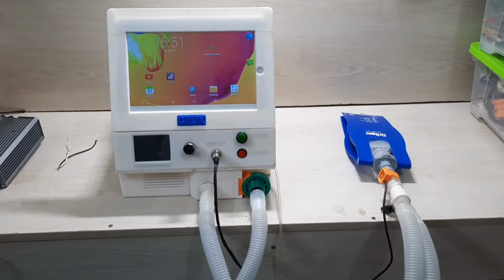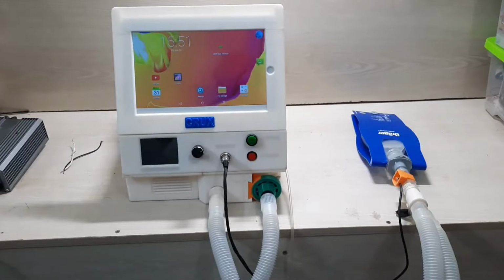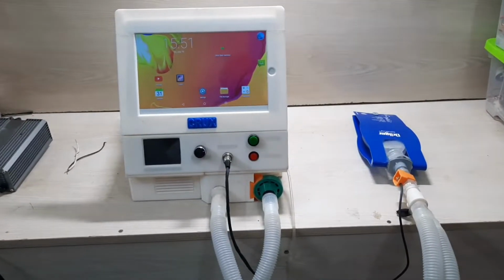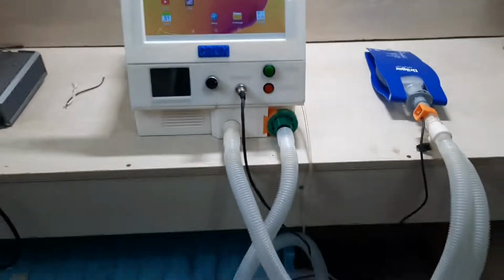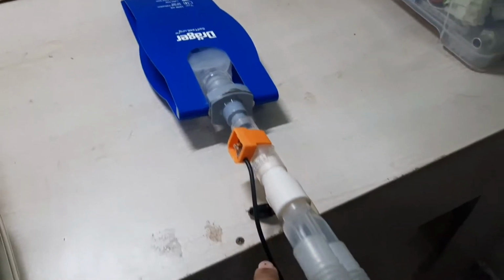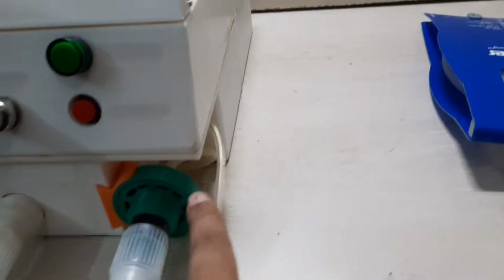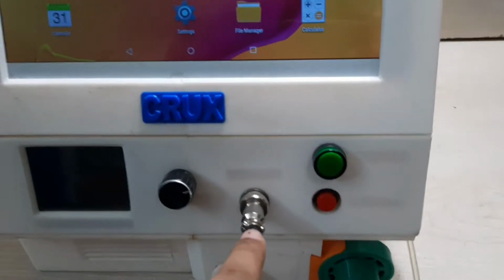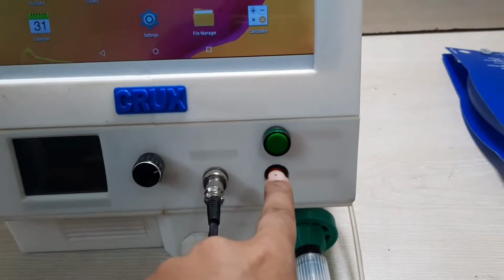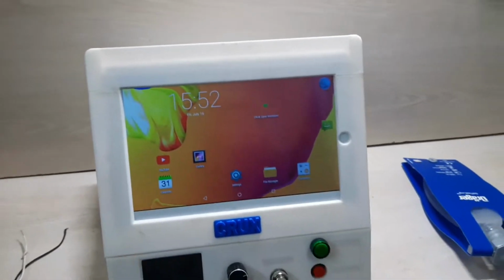Today, I am going to show you the basic operation of our open source turbine based low cost and extremely power efficient ventilator. So first, here you can see the test lung, the flow sensor. Here is a pressure sensor probe connected here. This is the PEEP valve. This is the connector port of the flow sensor. This is the reset button if needed for test purposes. And here you can see our main screen.